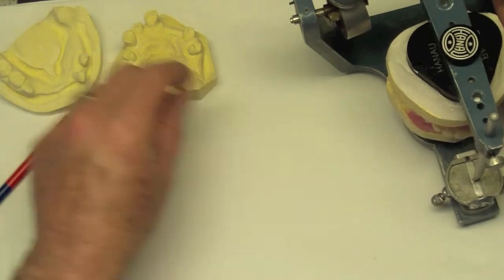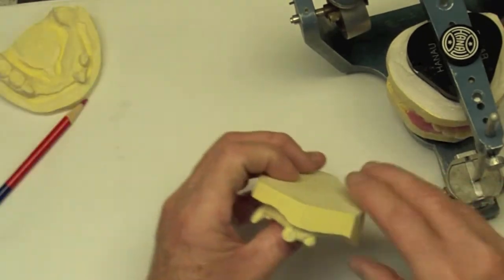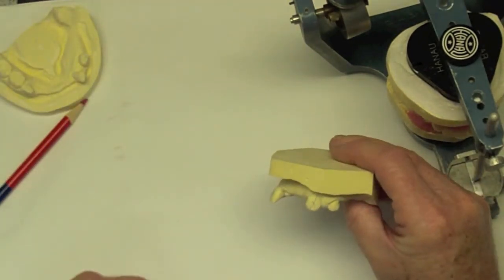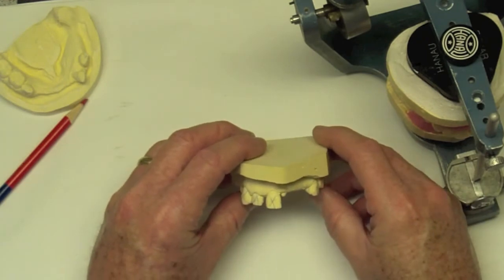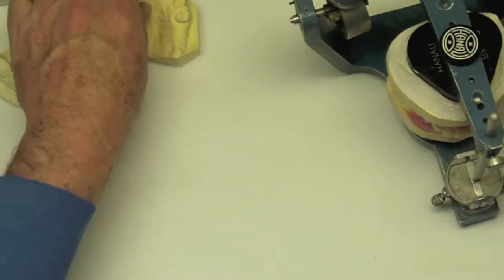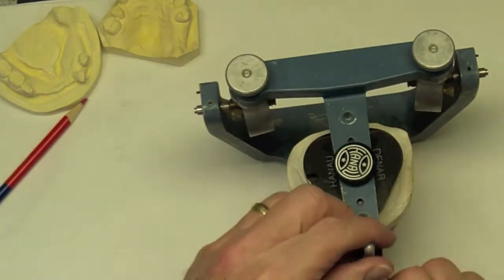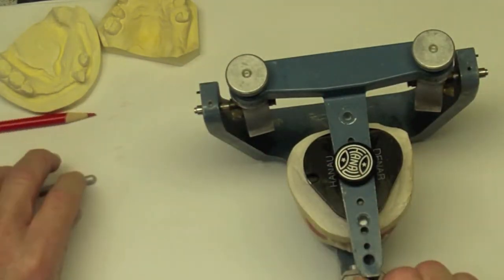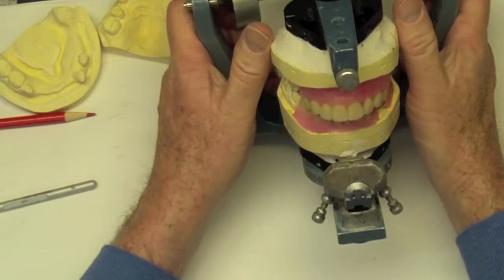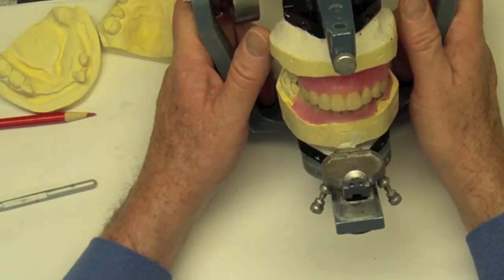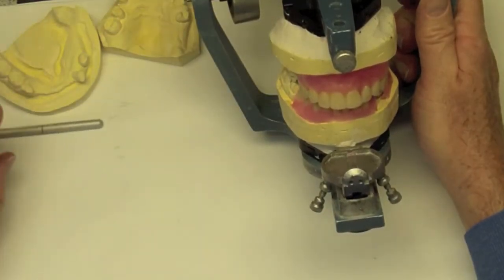To get kind of an idea of where we're going, here you see in profile and from an anterior view, the teeth that we have. And here's what we have proposed for the, I'm going to go ahead and take the pen out so it's a little easier to see, what we have proposed for the interim removable partial denture.